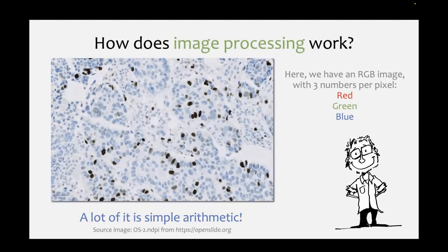Here I've got an example image, one of the Ki-67 images. This is called an RGB image, which basically means that we have three color channels: red, green and blue. For each one of these pixels, you can think of it as having three values - one for the amount of red light, one for green light and one for blue light - which then are mixed together to give you the color that you see on screen. You can think of it effectively as being three values for each of the pixels.